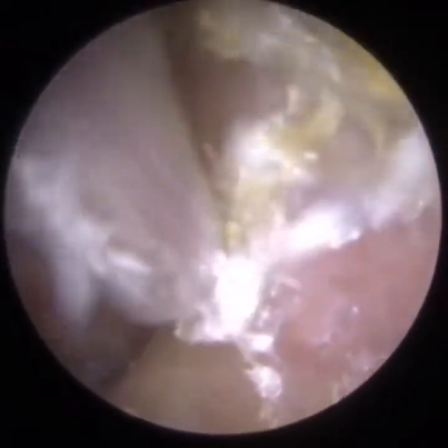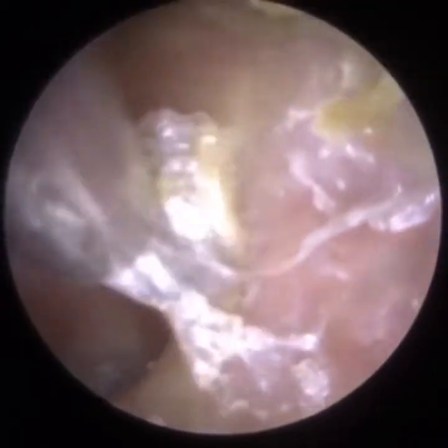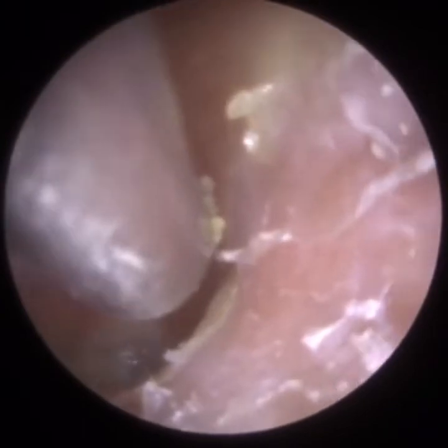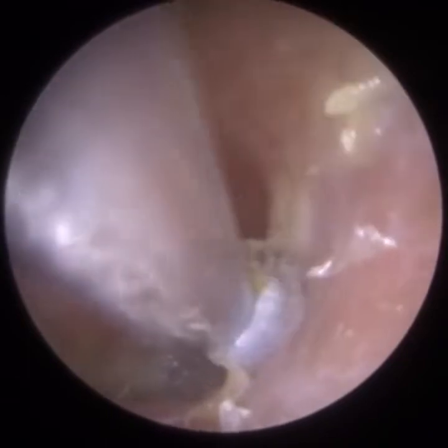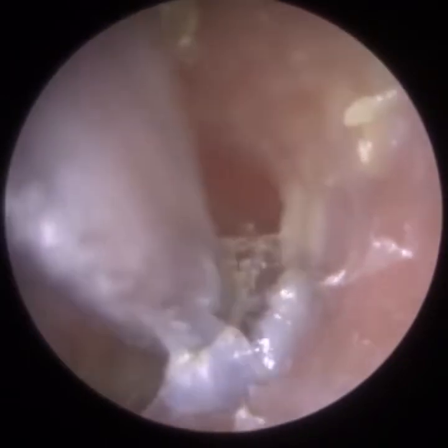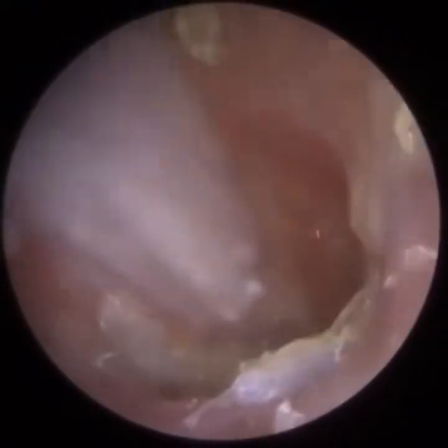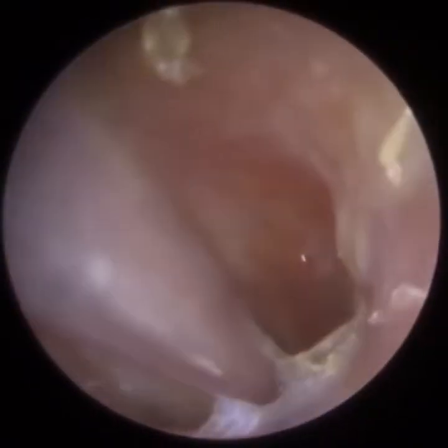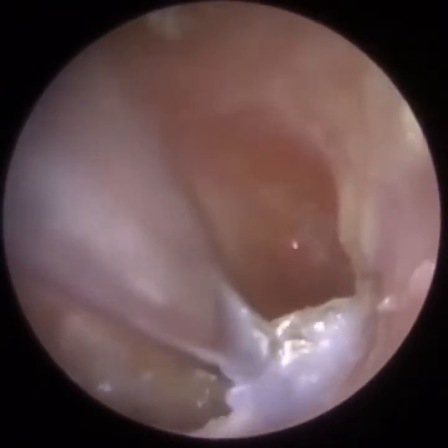So we just come back out near the entrance again on the posterior canal wall. I'm just using a full Zollner suction probe here, trying to elevate the skin. You can see I'm going to peel it all the way towards the patient's eardrum. It's this skin that I'm peeling now. I'm going to use a fine end. When I remove it, you'll be quite surprised. I was referring to this earlier. So this skin, the ear canal goes up and then the ear canal goes down.